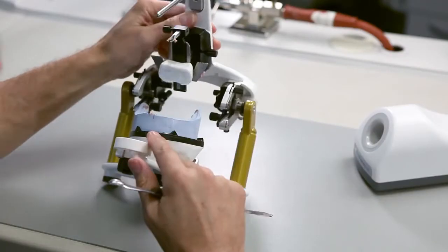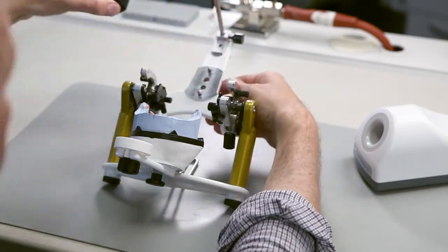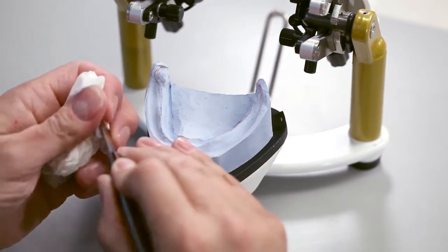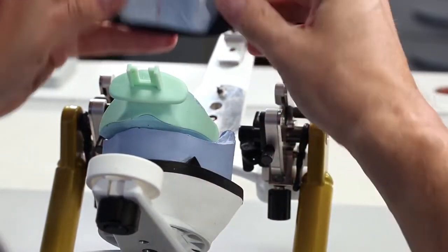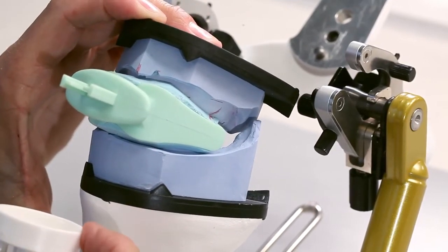Once the plaster has set, you can carefully detach the horizontal guide from the mandibular model and remove the instrument carrier. Also remove any interfering residues of sticky wax without damaging the model. Reposition the centric tray and check the fit together with the maxillary model. The markings simplify the aligning of the parts correctly.